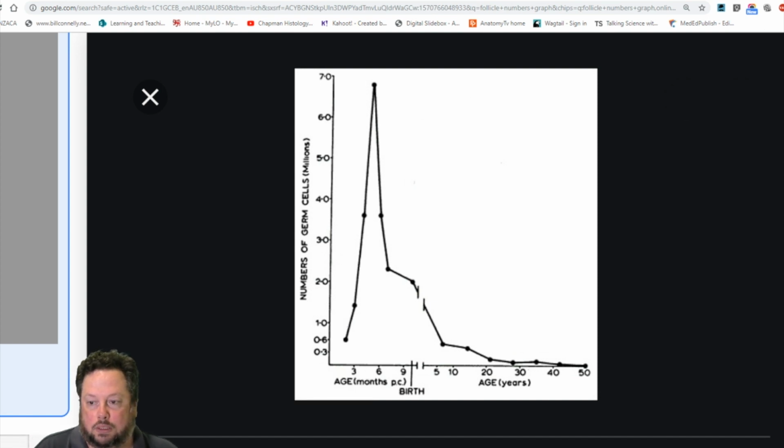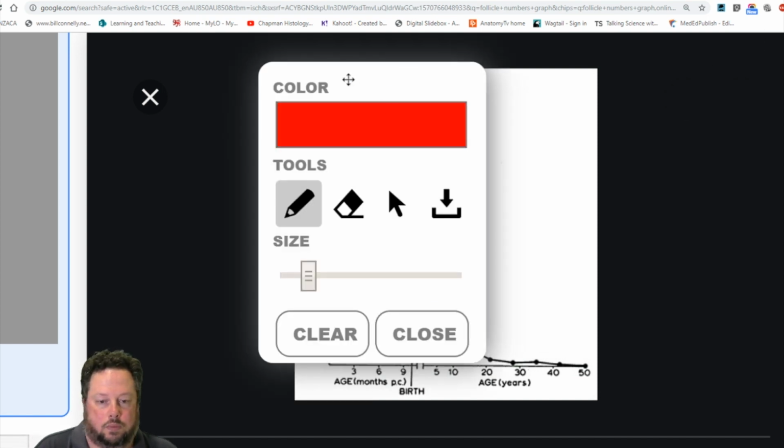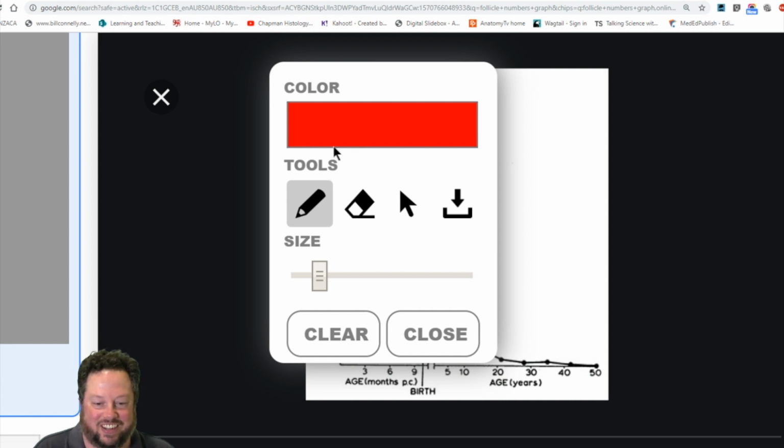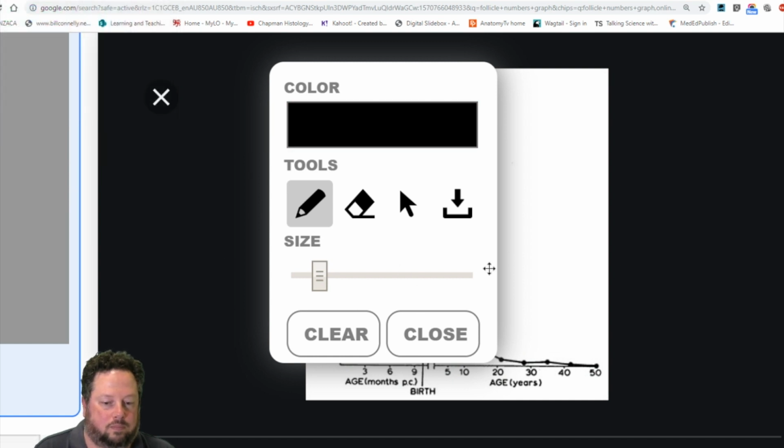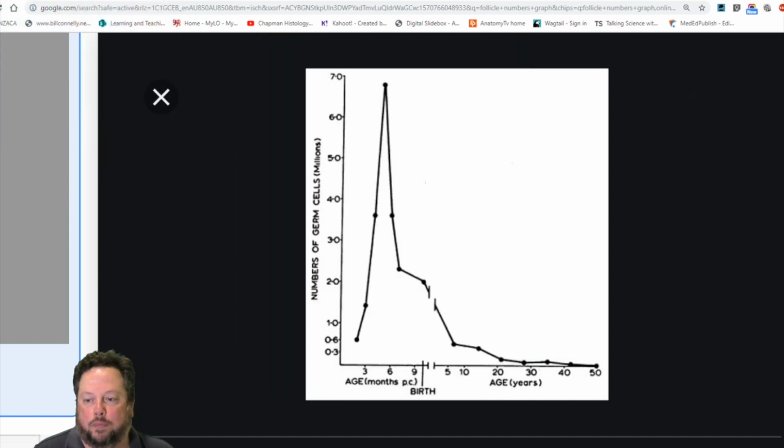That's not going to work. All right, so we're not going to draw. I'm just going to have to point things out.